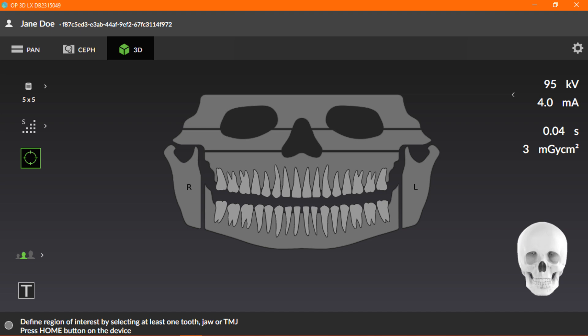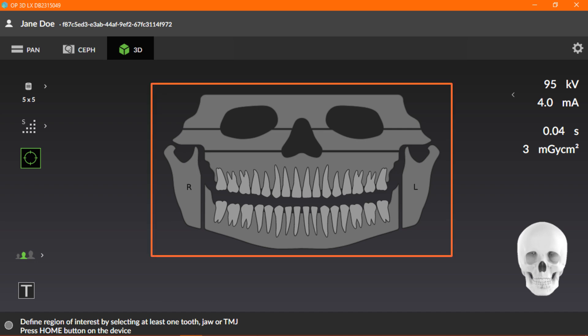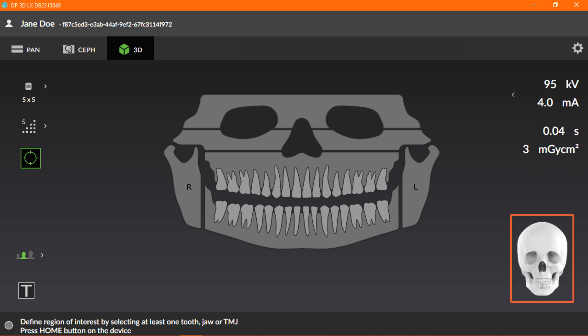Now, let's look at the different options and how to prepare the GUI for capturing a 3D image. The OrthoSelect Dental Chart is used to select the region of interest, ROI, for the 3D scan. The field of view changes automatically according to the selections.